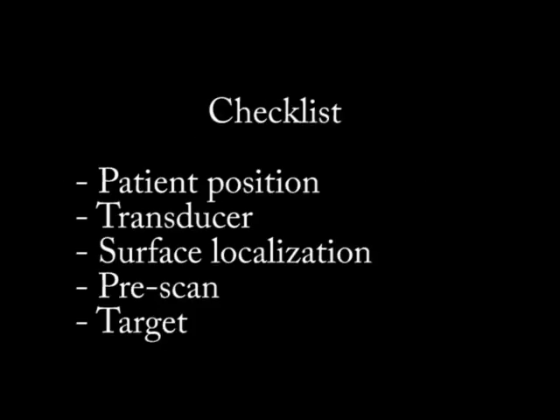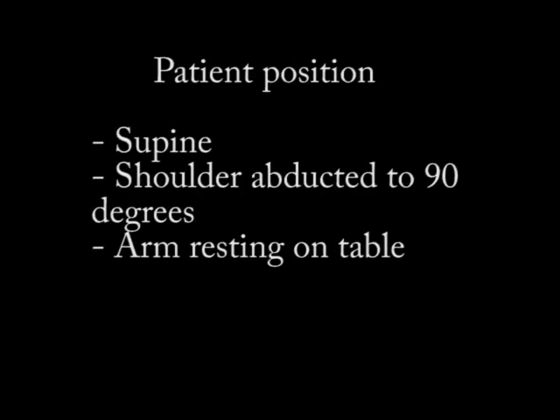Now, with any injection, I like to go through a checklist, and we're going to review these things. What's the ideal patient position and transducer? How do I localize my structure through the surface of the skin? What do I need to see on pre-scan? And how do I identify my target prior to an injection? So we'll go through that.